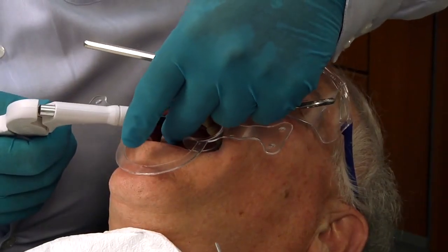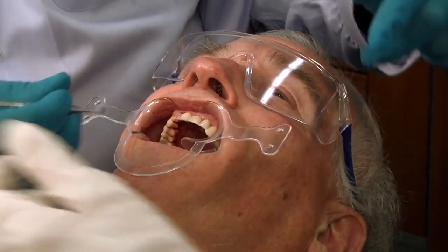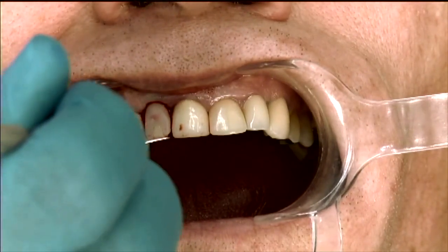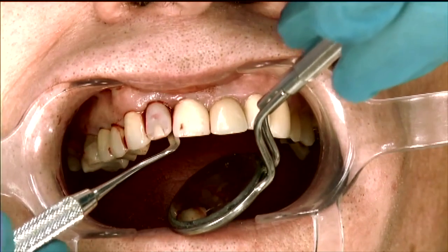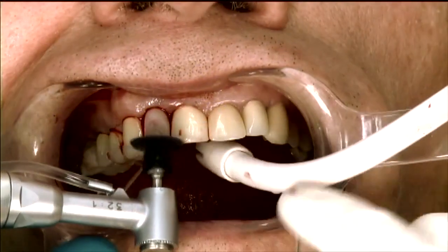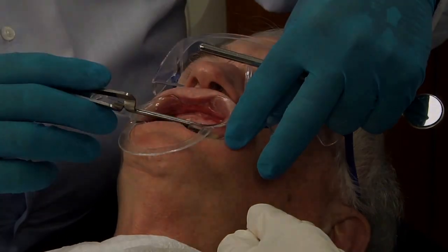And then we'll just quickly finish up. Usually what I do is get this done for today and we can have the patient back to fix any minor aesthetic issues. Have Ron bite down. Hold it. Open.